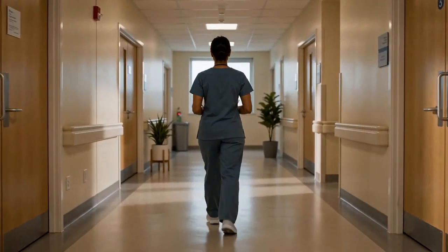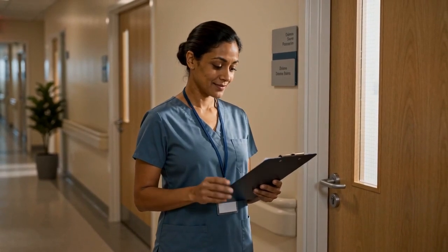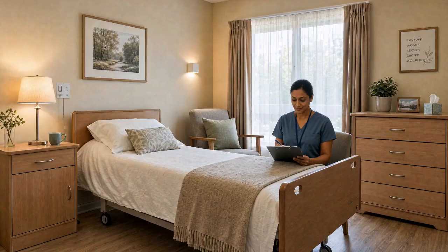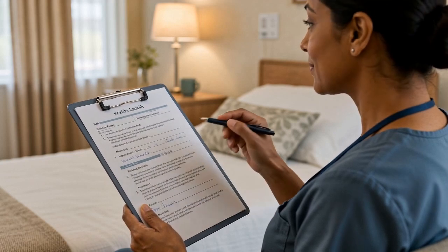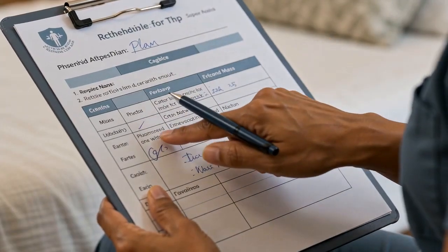Are they alert and behaving normally? Are they sweating, shaky, confused, unusually sleepy, weak, or complaining that they do not feel well? Never rely only on the glucose number when the resident is showing concerning symptoms. Follow the resident's care plan and your program's procedures for abnormal readings or symptoms.